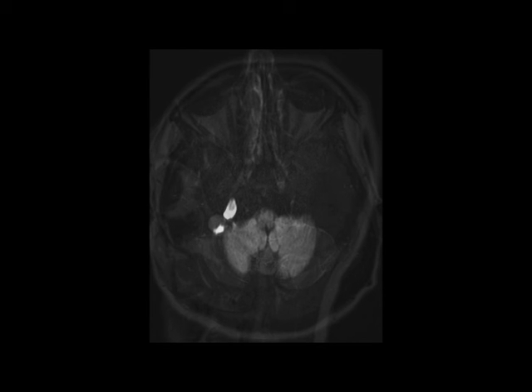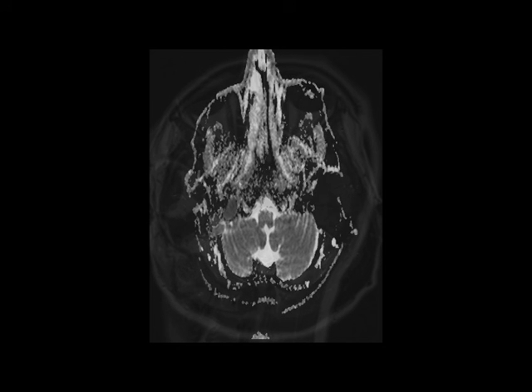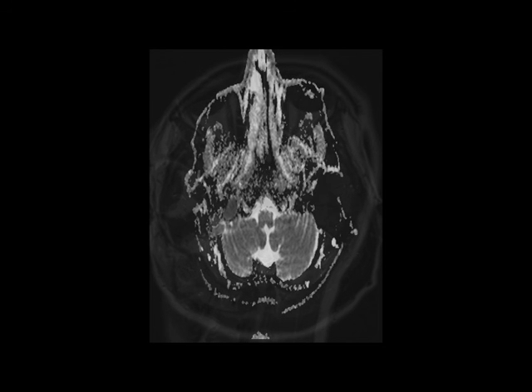The findings are confirmed on the DWI and ADC maps where there is diffusion restriction at the sites of thrombosis. The 3D maximal intensity projection MR venogram confirms the absence of flow within the thrombosed transverse sinus, sigmoid sinus, and proximal right internal jugular vein.